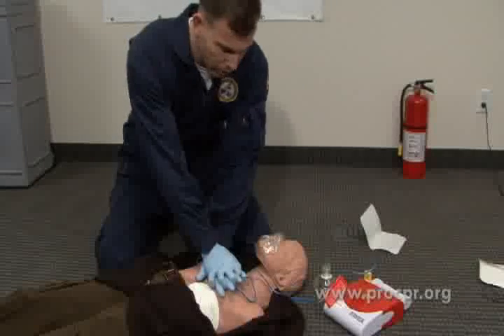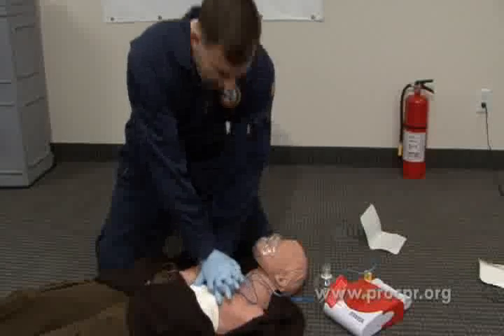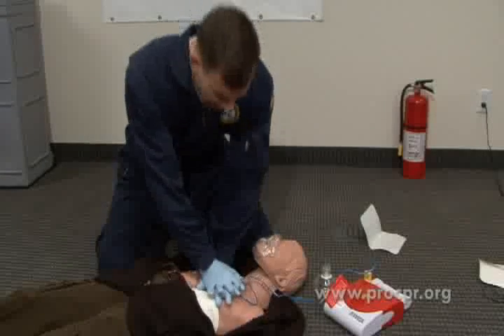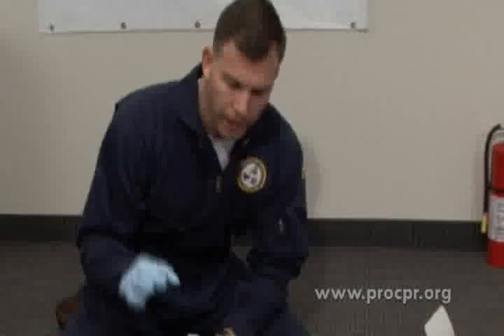Center of the chest between the nipples. 1 and 2 and 3 and 4 and 5 and 6 and 7 and 8 and 9 and 10 and 11 and 12 and 13 and 14 and 15 and 16 and so on up to 30. We're going to do this for approximately 2 minutes.